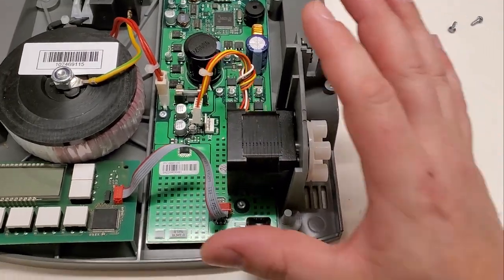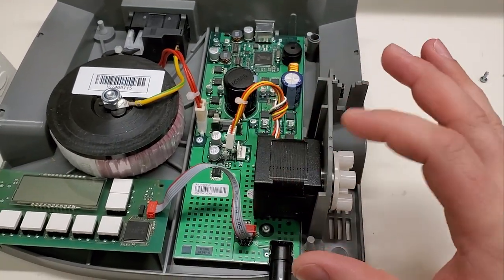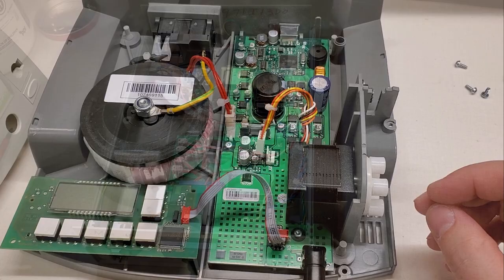That would be a stepper-based system. It's very simple. It doesn't matter. It's very easy to test to see if it's bad. And next, we are going to go into a servo drive system.